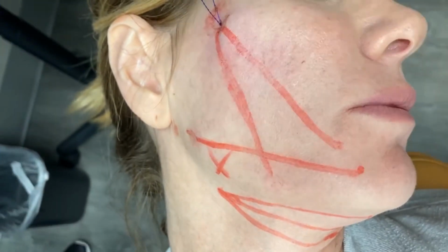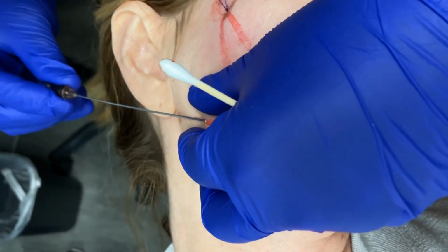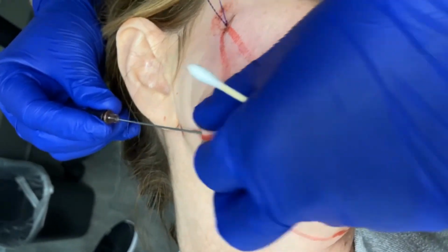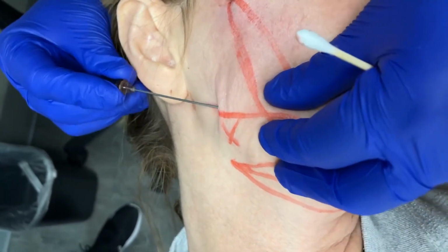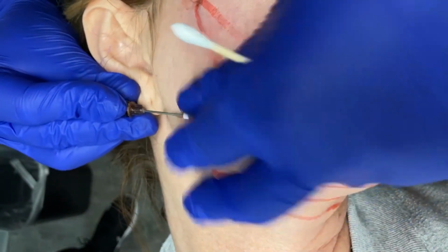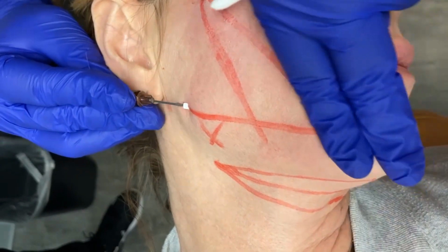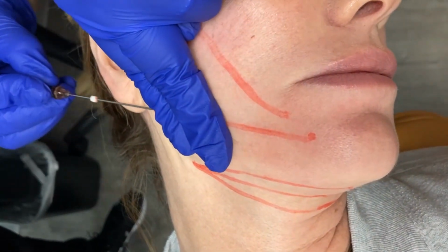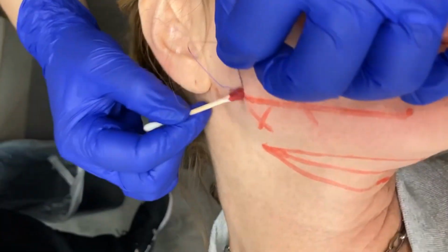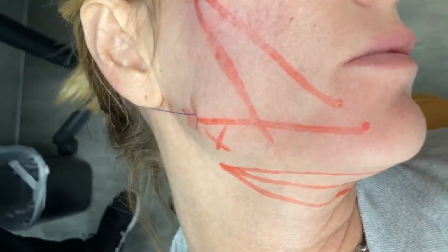Best microcannula on the market for sure. It is not too flexible, and it really goes to place exactly where we want it. Now the thread goes in very easily, always knowing where it is, making sure we're in the right plane, and using your other hand to push the tissue over this. As you can see, get it to place. Now exaggerate that lift, pull it straight out, and you can see a gorgeous lift right there. And that's the way you have three threads to accomplish this, and that's the way to do it.